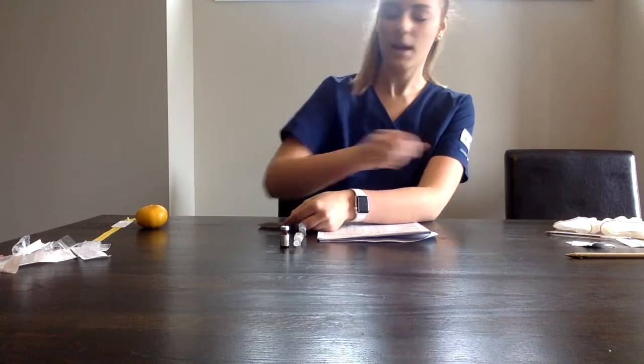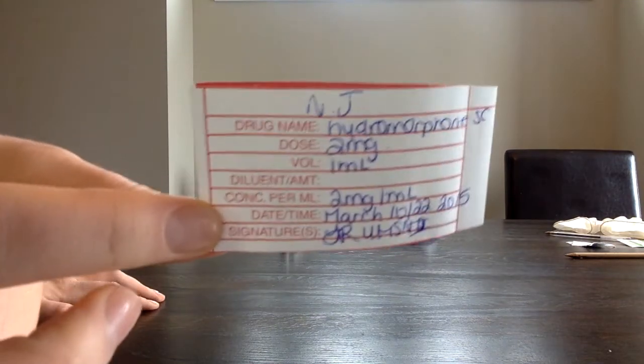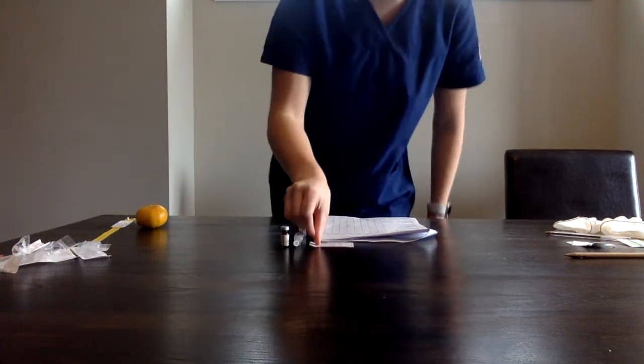Okay. Again, I wouldn't leave my meds unattended, but I do need to show the camera my label. So we have all the information on the label. And then we can proceed with doing our second med check.